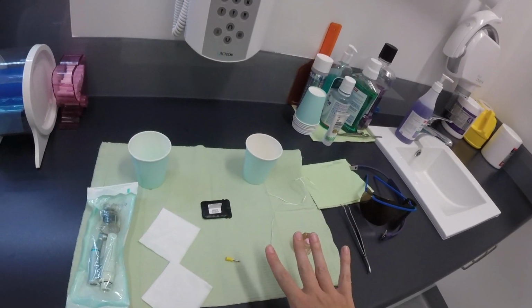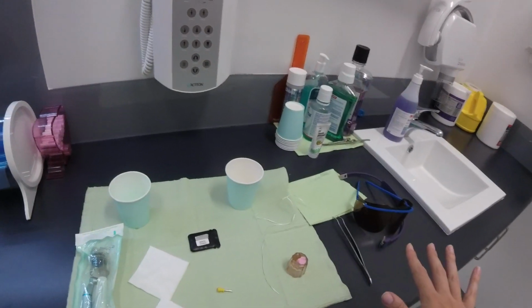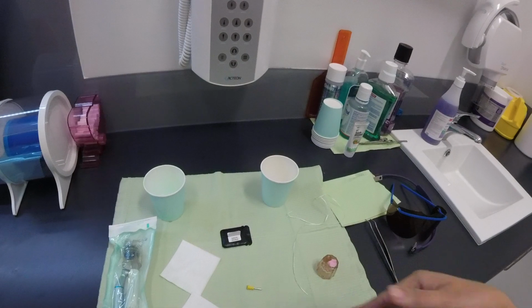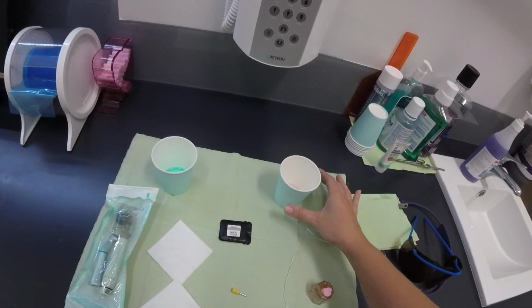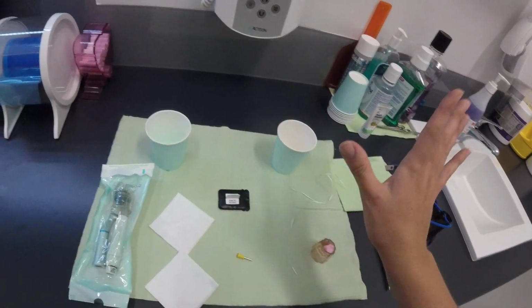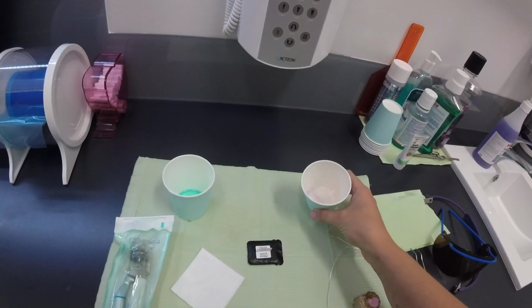I like to leave it until the end just because in the past I've had patients ask if it's from the last person that was here. So I make sure I keep it on my side, or I put an empty cup on their side and let them watch me fill it up. At the end of the procedure, we ask them to have a rinse out.